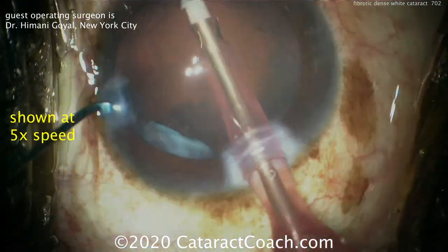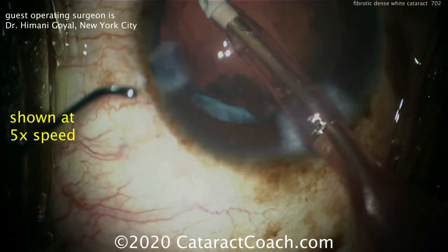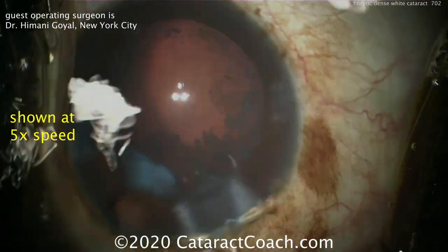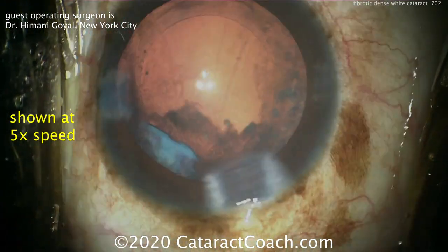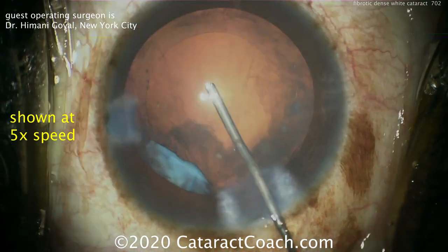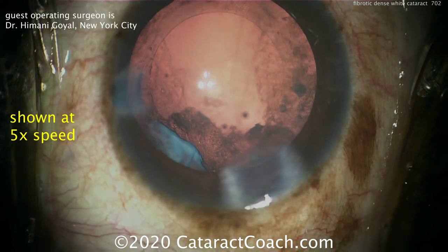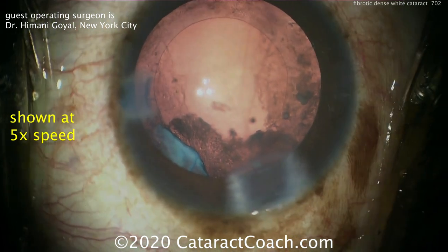The cleanup goes pretty well, but there's one area between the paracentesis and the main incision where there is a big opaque plaque — also the spot where the anterior capsule was stuck. The central visual axis is nice and clear, so we can put our lens in. The question remains: how to remove the rest of this opaque area.